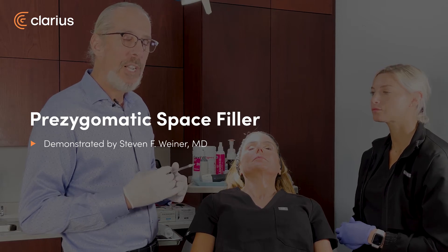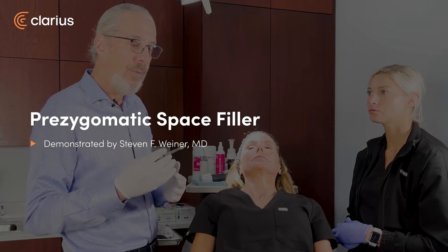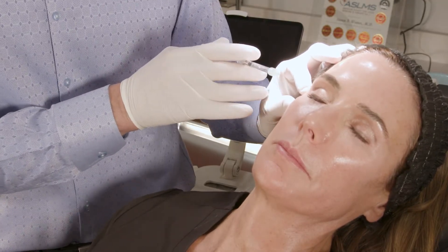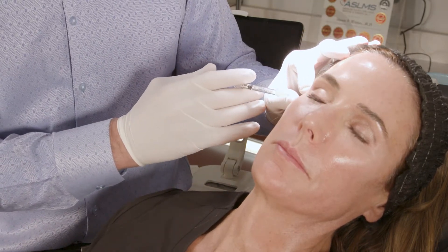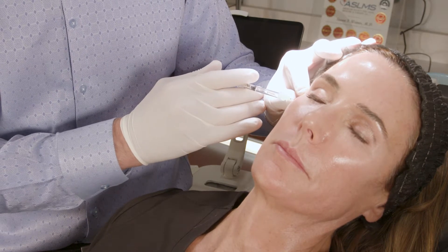What I'd like to do first is numb the injection points with a little lidocaine with epi. I'm going to use an injection point to do the prezygomatic space, which is this space right here. I probably could use that same location I'm using for the temple, so I'll inject it just a little bit more.